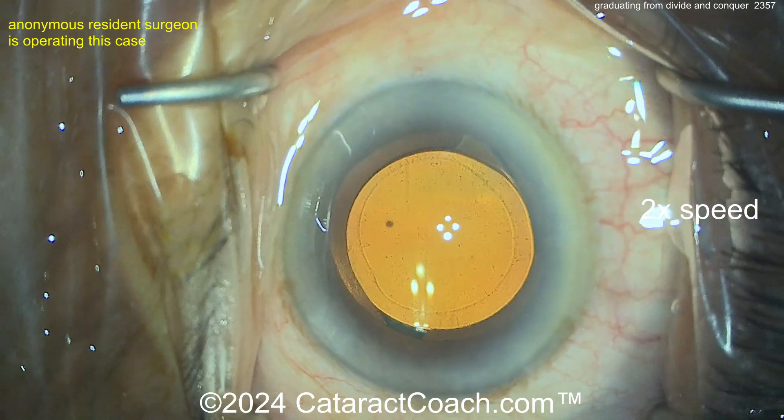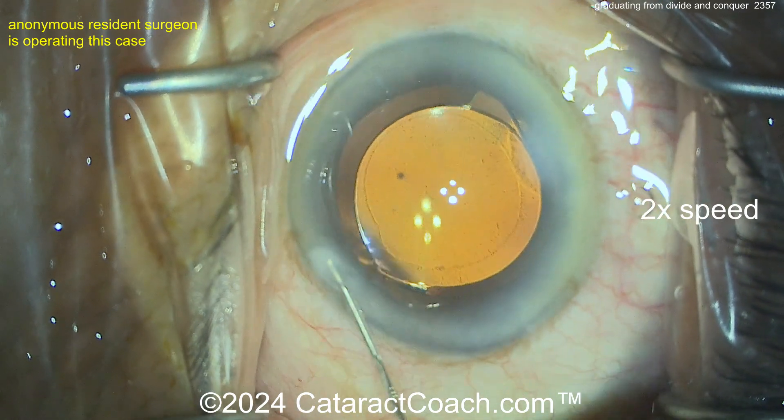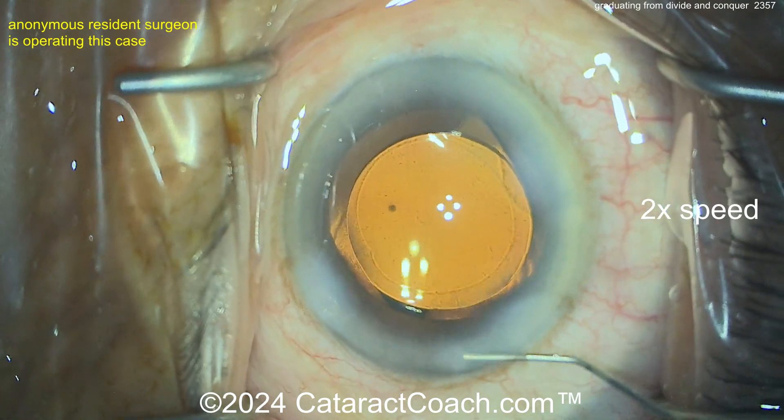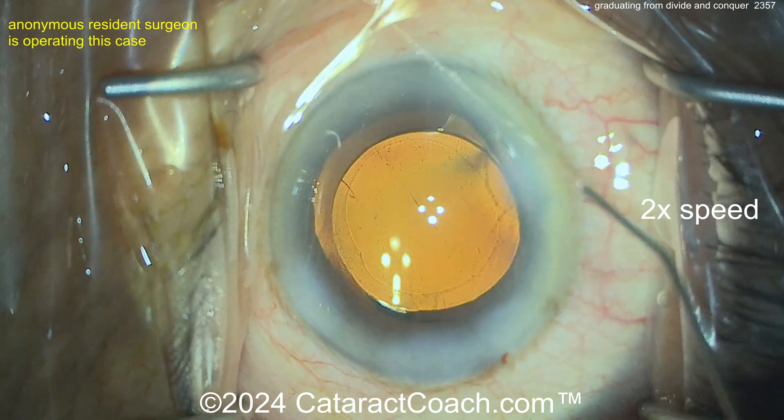I like it! Let's see that rhexis size — look at that beauty. You did a fantastic job. Now let's see how you hydrate the incisions. That's a little bit aggressive on the hydration for me. Just do the central roof — that's far more important than the walls. But you know what, you're doing a great job — fantastic.